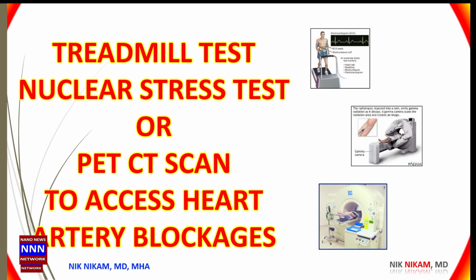The second type of test that we routinely do in a hospital setup or in a doctor's office is known as the nuclear stress test. So we can either do a treadmill stress test or a chemical stress test to increase the blood circulation to the heart muscle that is combined with a nuclear scan of the heart. And I'm going to show you some pictures and show you the differences. And that will help us to not only look at the blood circulation to different regions of the heart muscle. With the nuclear stress test, we not only can determine the reduced circulation to a given particular region of the heart muscle, we can also see how significant the blockage is.